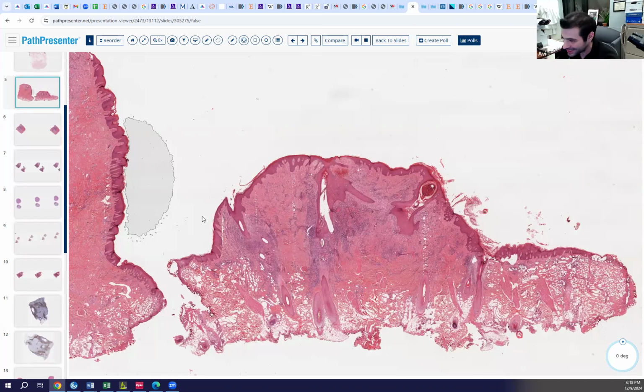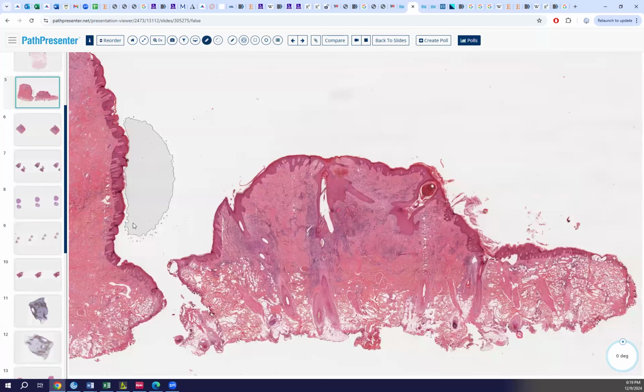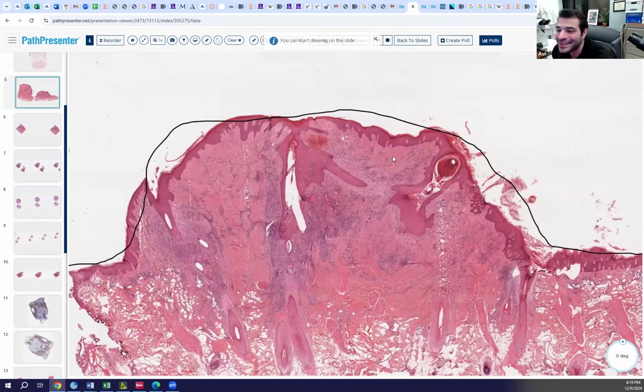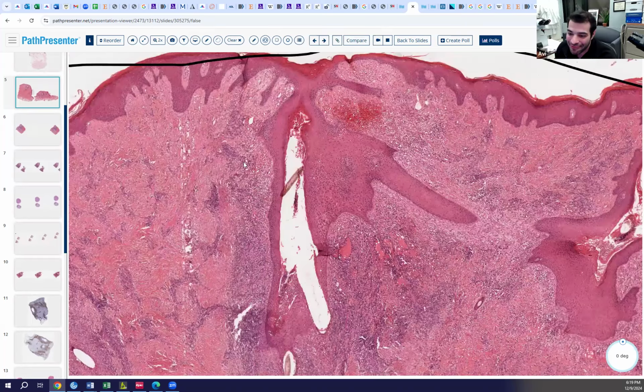You see bumps, multiple papules and nodules, skin-colored fibrotic nodules and papules, usually on the neck. And what shape does this have? Here's normal. Papule or nodule, depending on the size. But look, it's coming out. This is what a clinician's going to see, a papule or nodule. That's the architecture of it here. So this has everything for AKN.